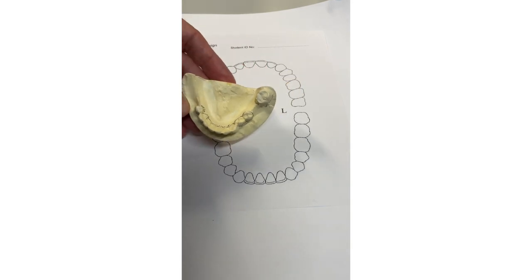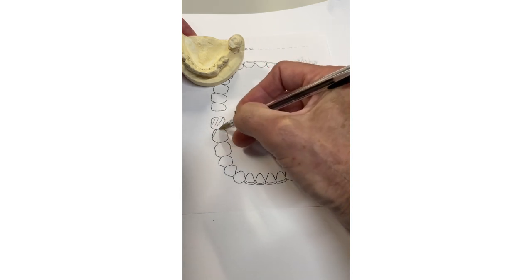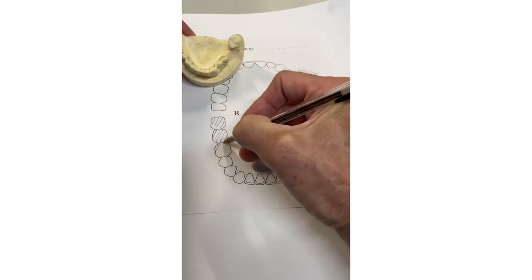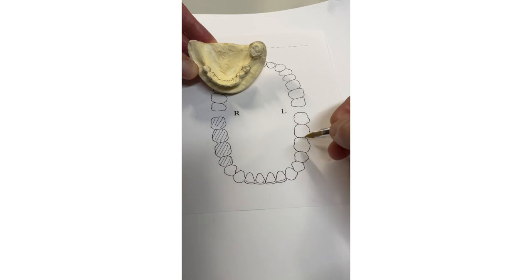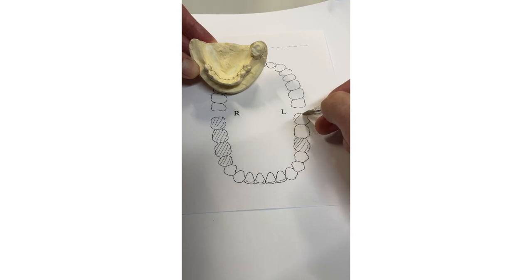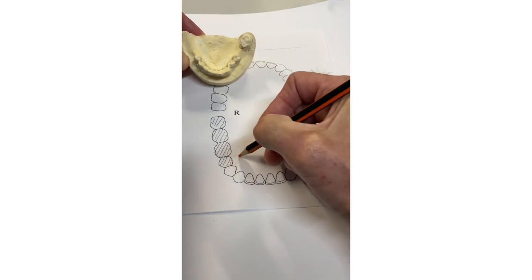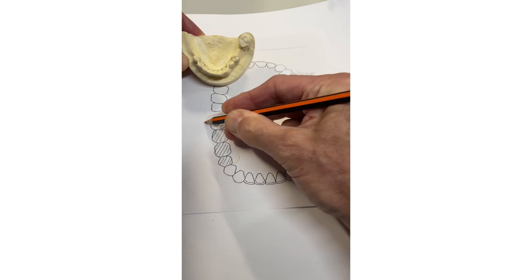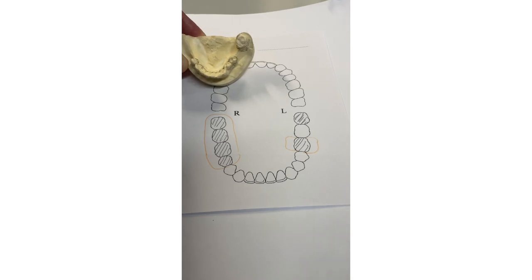Case number five: unilateral free-end saddle with an additional saddle. As ever, block out the missing teeth — remember the saddle goes back as far as the retromolar pad even if you're not replacing the eights. We've got no molars and a lower first premolar missing on this side; we've lost the six — call that a seven — and the eight's missing but we're not replacing it. Make the lingual part of the saddle acrylic, not chrome, as it's easier to adjust. Draw the saddle full size going back to the retromolar pad.